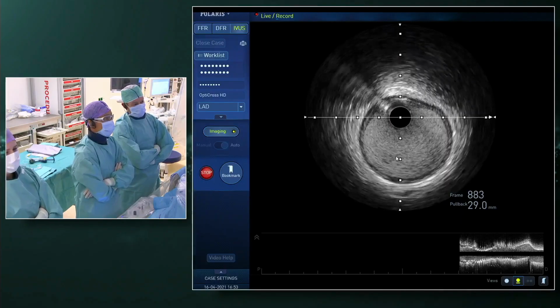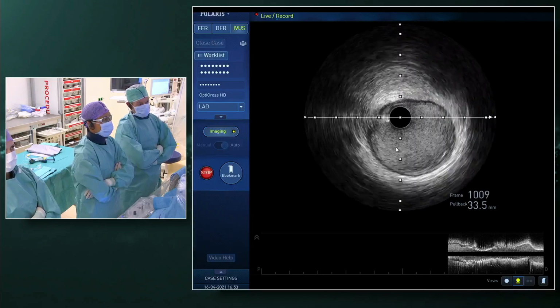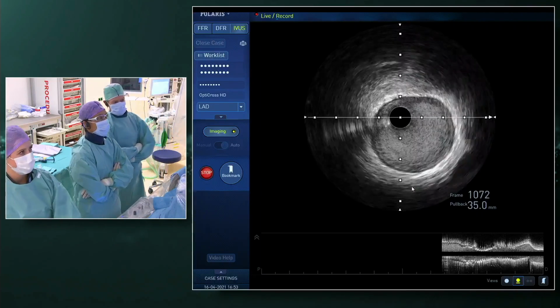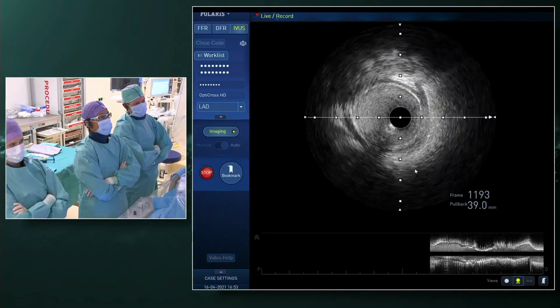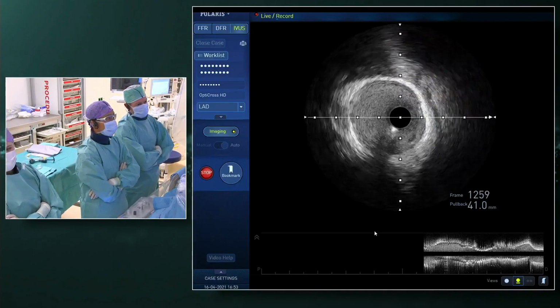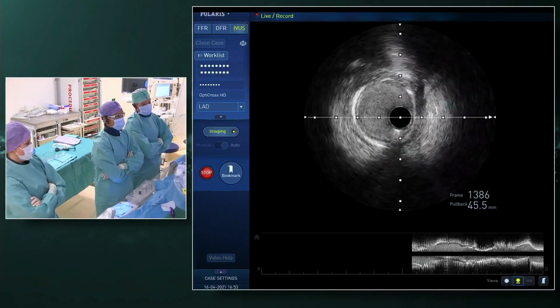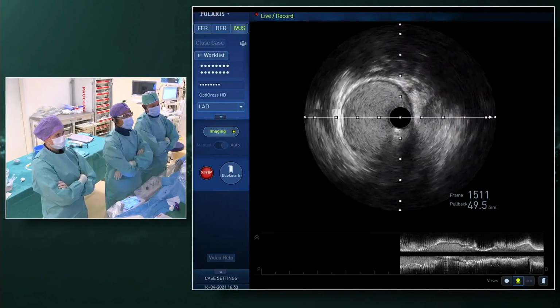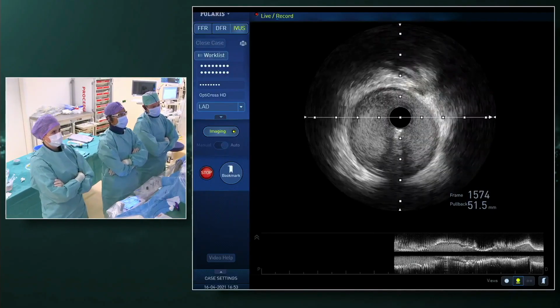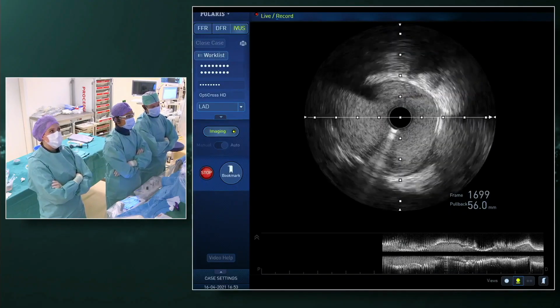Here we have some malposition in the proximal edge that we're going to attend to. It was unavoidable. We landed in a very large part, and we saw that already, so probably you're going to do something about it. And now we're going to the proximal stent, and remember there we had a very big concentric plaque with some cracks in there, and see how the stent behaved.